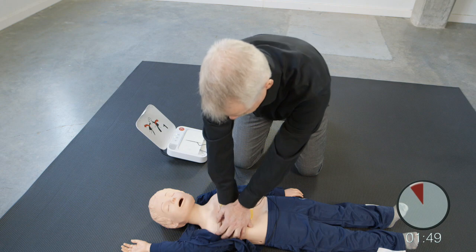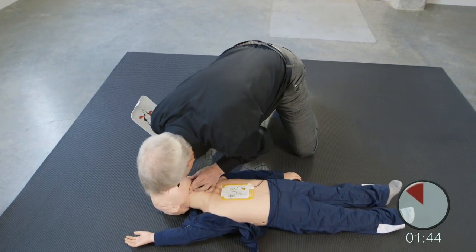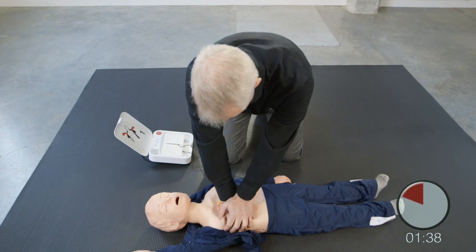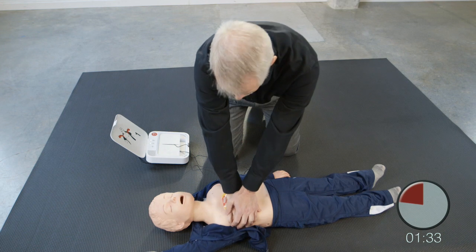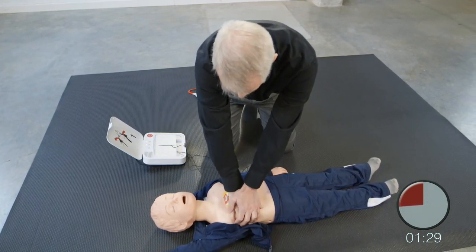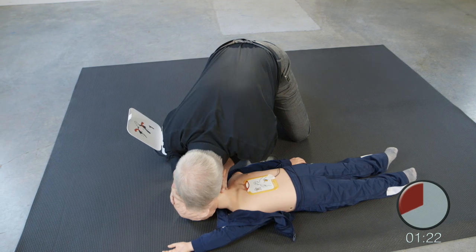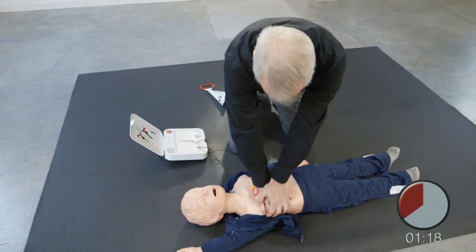Provide two breaths. 1, 2. Resume chest compressions. Push down deep. Provide two breaths. 1, 2. Resume chest compressions. Push down deep.